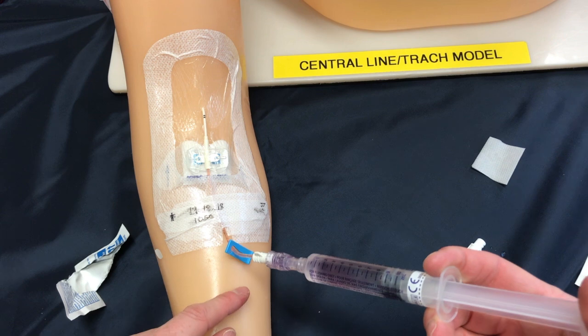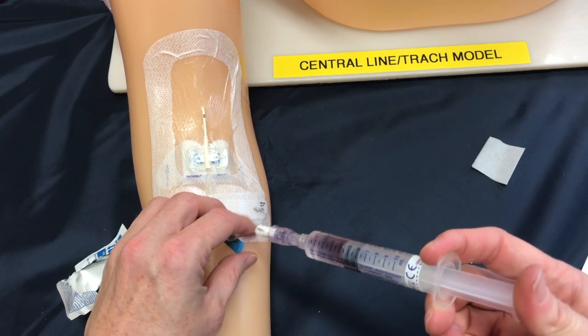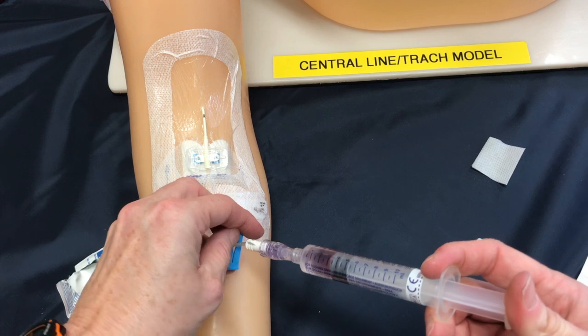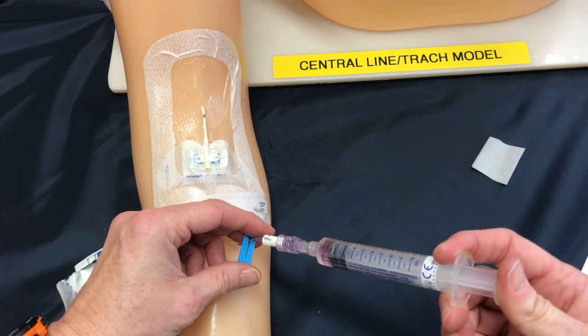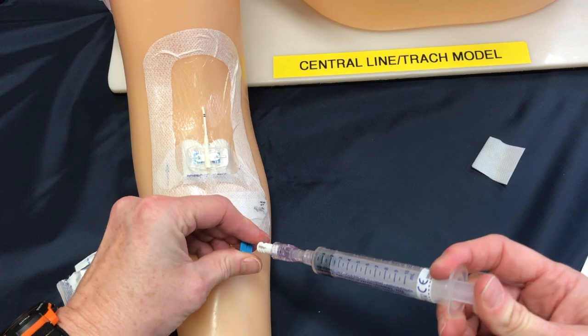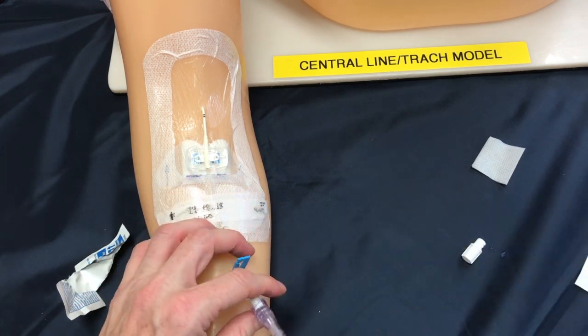Now we can go ahead and infuse the remainder of our saline using a pulsing pressure, and in your last one mil you want to be clamping off the lock. Now if it feels like you need to force this fluid, then you may have a positional line or a partially clotted line and you'll want to stop the procedure and troubleshoot it.